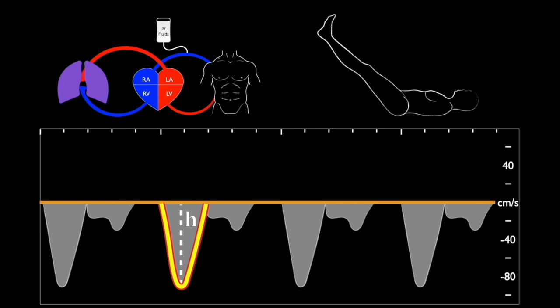Straight leg raise is great because you can do it right immediately in the room, see if that increases their cardiac output. The difficulty with a straight leg raise or even either one of these is if you can still get the apical 5 chamber, which may be a little bit difficult in just a supine position. But it is possible, and you can try it.